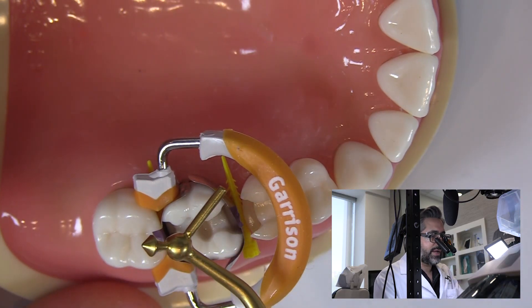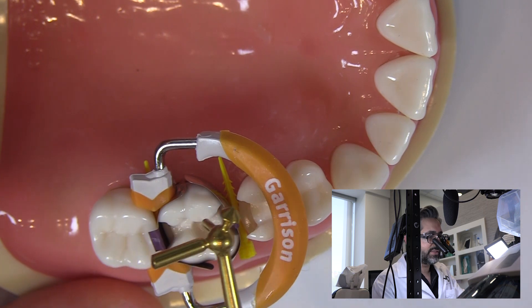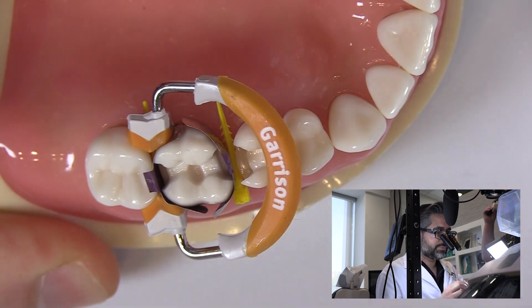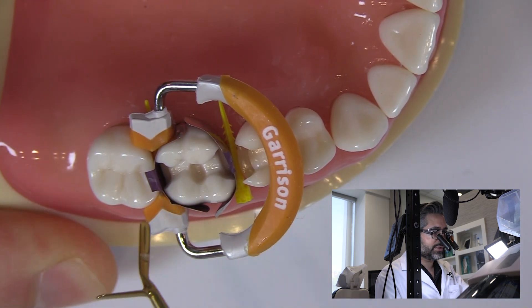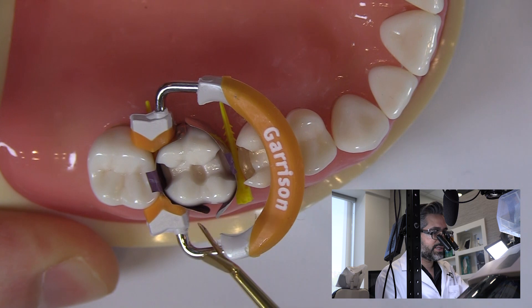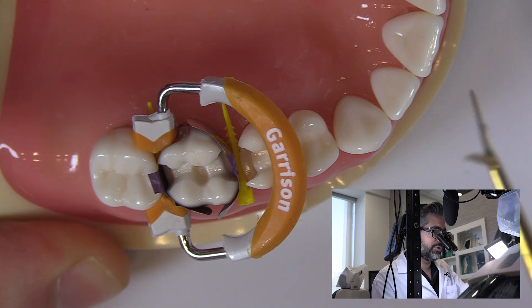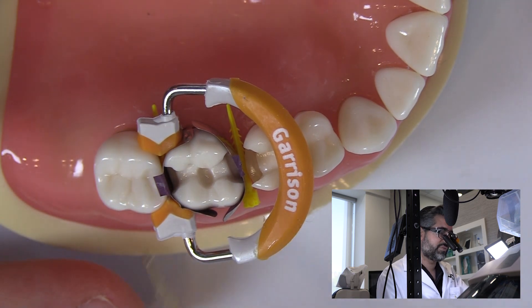Now that I have the ring in place, I'll use a small round condenser to make sure I have contact — it's not exactly burnishing, I'm just making sure the band hasn't creased or folded. I'll inspect the band slightly to make sure I have a good seal. When you see excess here, you can fold it over to give a little bit of space, or pack Teflon tape into this area. Another way to deal with it is to use flowable or Opal Dam — put it in here, hold it, and cure it so that you get a nice contour. Usually if I have a contour like this, I'm okay finishing with a 12 blade. I'd rather have a little extra to work with than not enough in the margin areas.